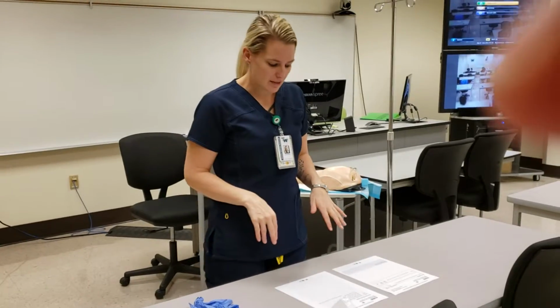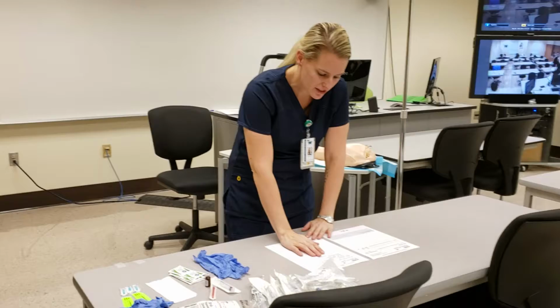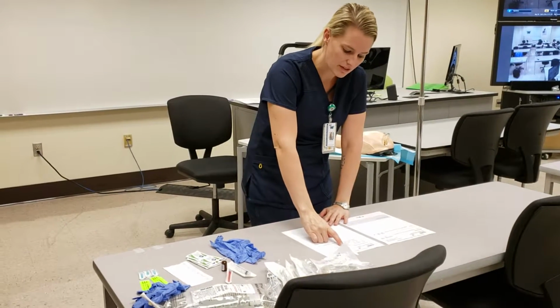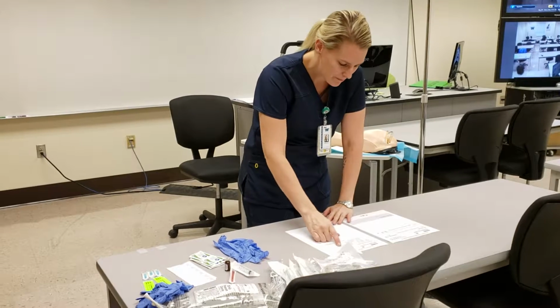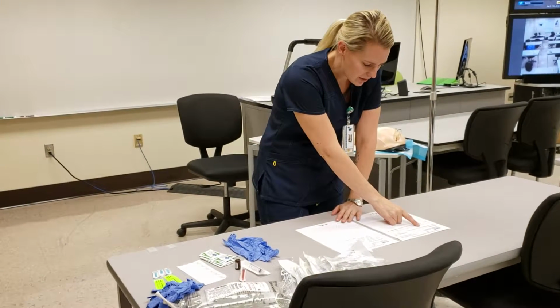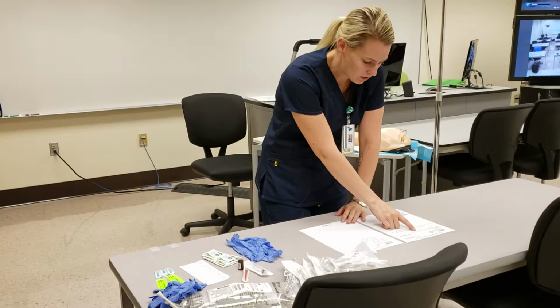I'm just going to verify some orders to my MAR for my patient Shirley Cost. The doctor's ordered lactated ringers 1,000 milliliters with 20 milliequivalents of potassium chloride IV. So I have this in my MAR. Lactated ringers 1,000 milliliters IV with 20 milliequivalents of potassium chloride.